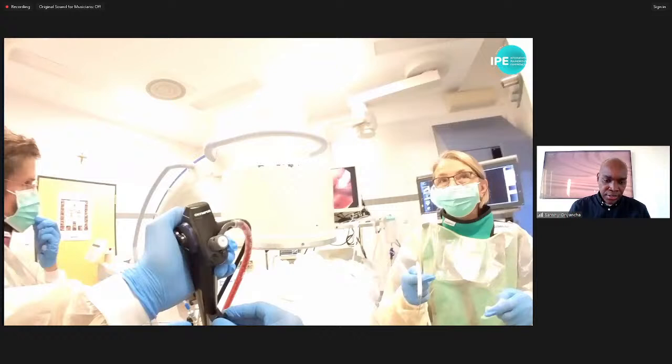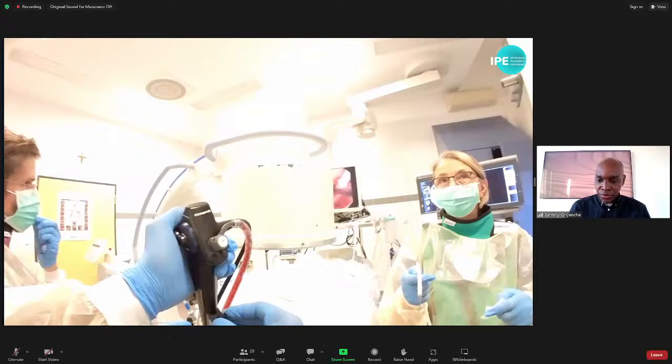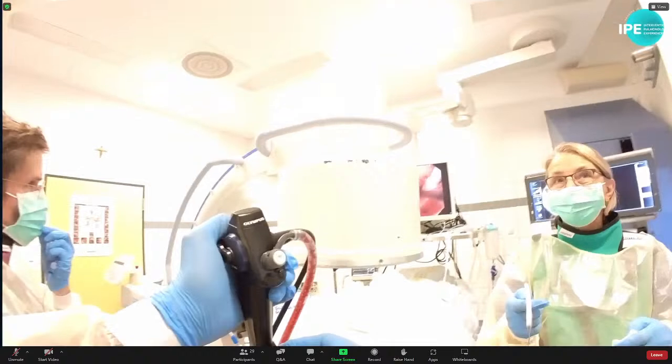So here's a demonstration of us doing a cryobiopsy on a patient who had suspicion of an NSIP. He's intubated with the rigid scope. My colleague is on the side to the left of me with the balloon ready. The nurse is on the right, ready to take the sample. So I'm going to play the video.